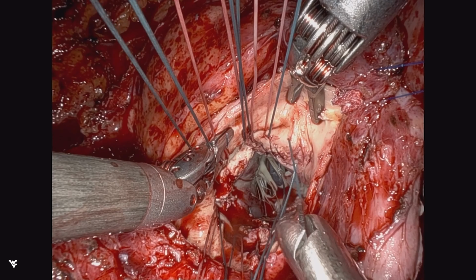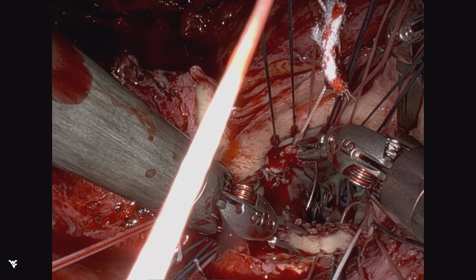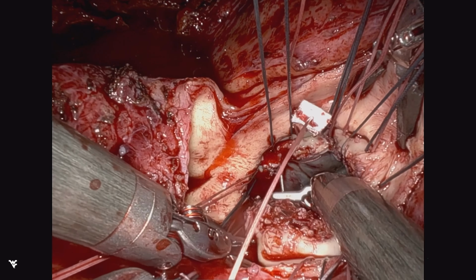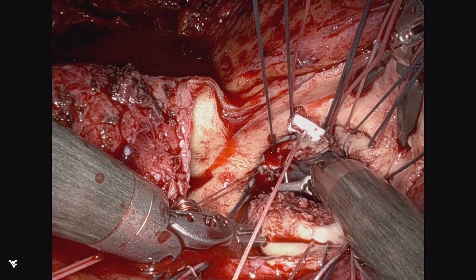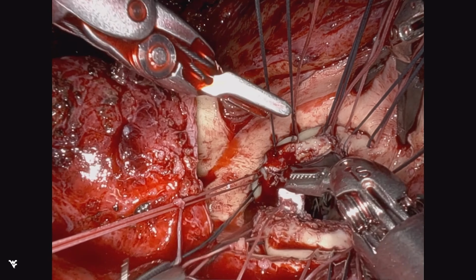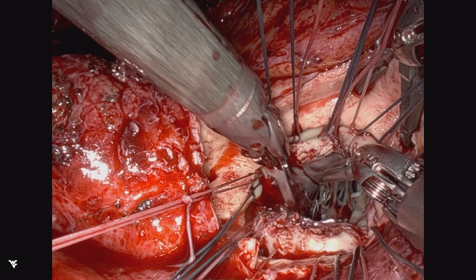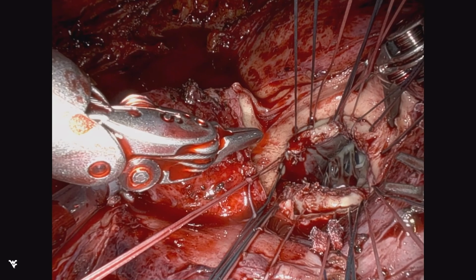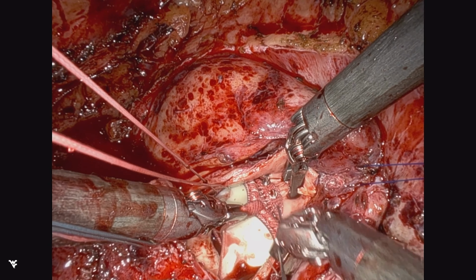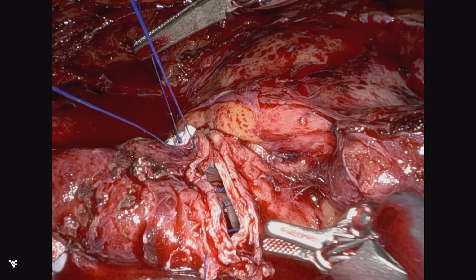So now we've kind of rebuilt the annulus to my satisfaction, and then placing the sutures. As you notice, we really don't have to use pledgets. We tend not to use pledgets, but in this case, at this location, which is where we really had to get deep in the debridement, I'm going to support the annulus with a single pledgeted stitch, really just for added sense of security. This is a rare situation in our program because we don't routinely use pledgets, but it illustrates that you can't be dogmatic about everything and adapt to the tissue as needed.